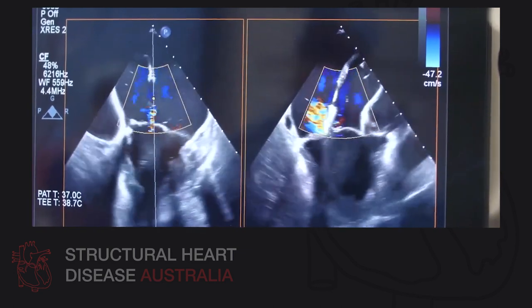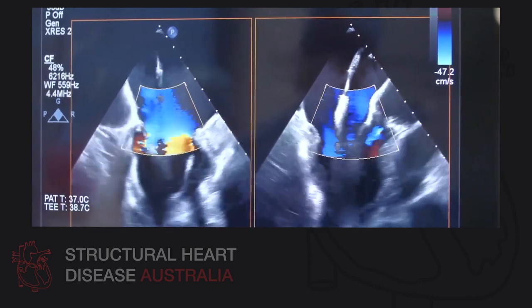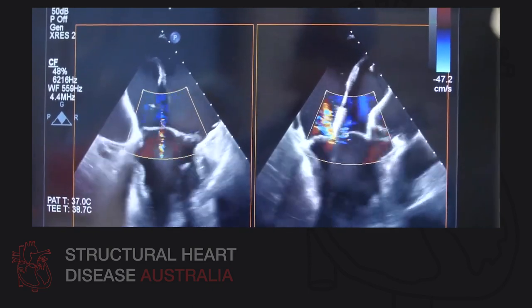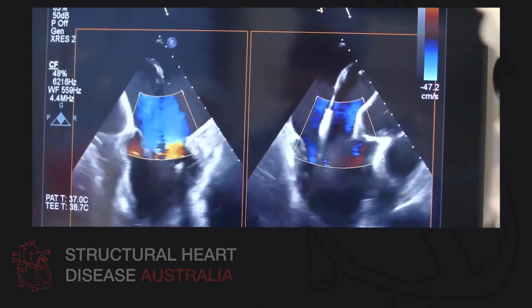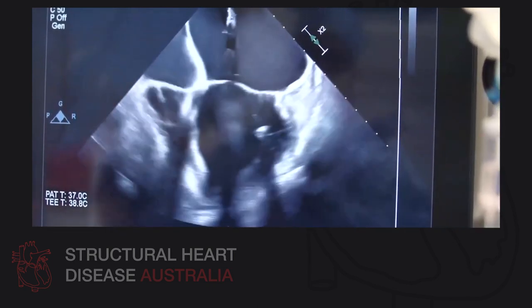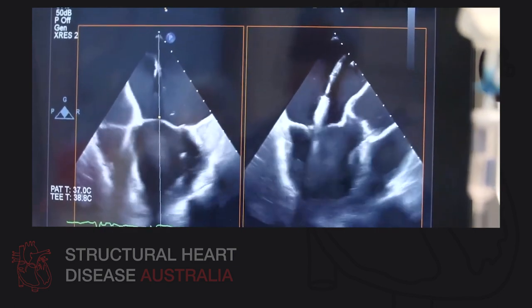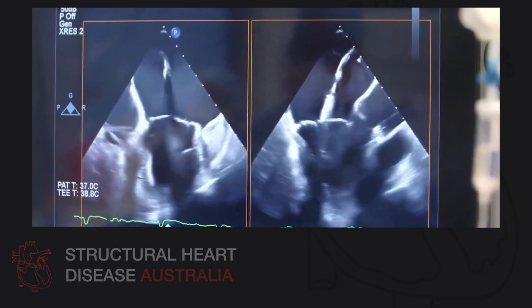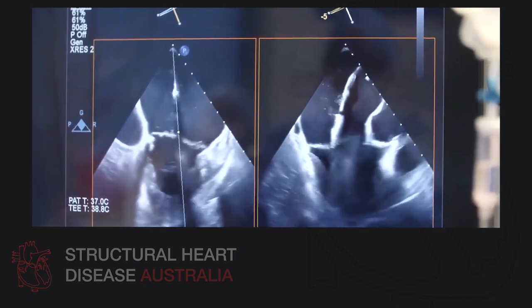So Lisa, looking at that, it looks like maybe we're a bit too medial. So I might take a little bit of M off the system, right? M is the medial flexion knob of the device. And I might just bring the whole system forward. So now it looks a little bit more central.